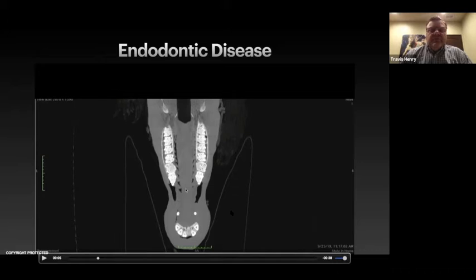When we performed the oral exam on this horse, we saw that the teeth in the 7 position here were kind of dysplastic. So you can see how the pulp horns are crammed over towards the buccal side of this tooth, and then there was a production of cementum on the palatal sides of these teeth. Also, it had a missing incisor that we can see here. So that gives you some background on this horse's clinical exam.